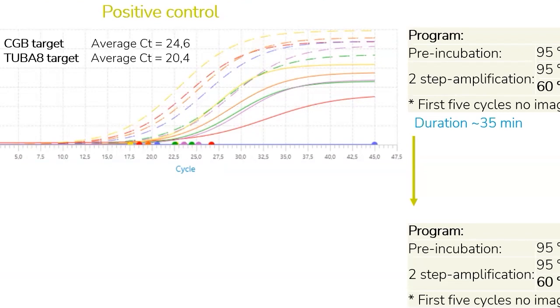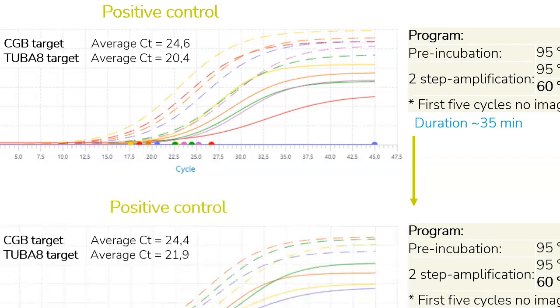We reduced the amplification time by 3 seconds, and doing that, we won 4 minutes of runtime. Doing so, we did not compromise fluorescence intensity or CT values, although there was a slight decrease in the number of technical replicates. The Fluxergy's requirement of at least 2 positive readouts was more than fulfilled.